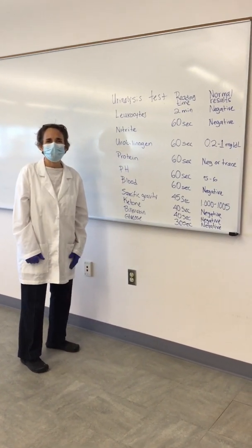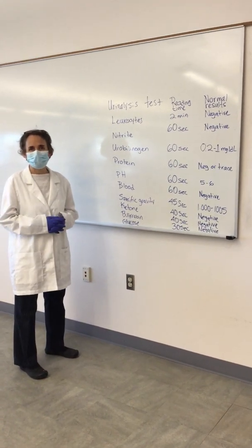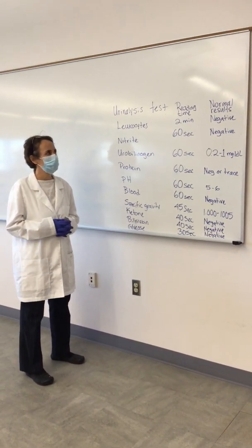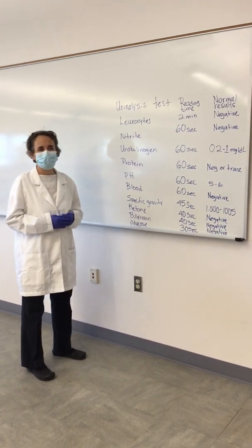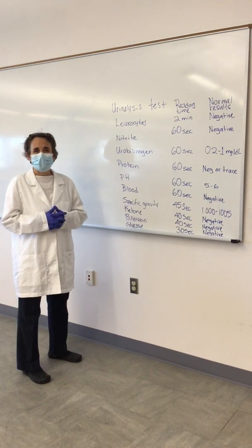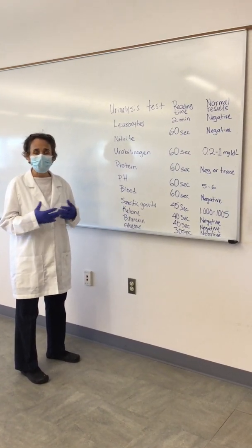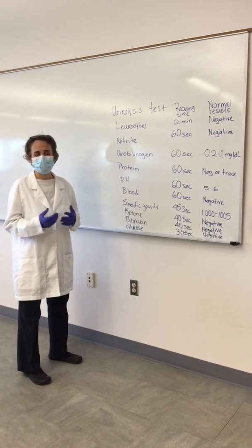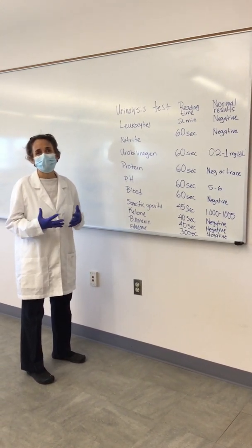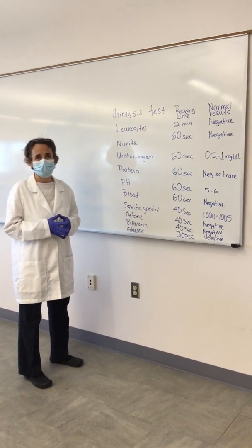So in this video we're going to look at the way to perform a urinalysis and give some interpretation. Urinalysis is one of these tests that is simple to make and gives so much information before performing other tests. And this test specifically, of course, is directed to study problems in the urinary system.